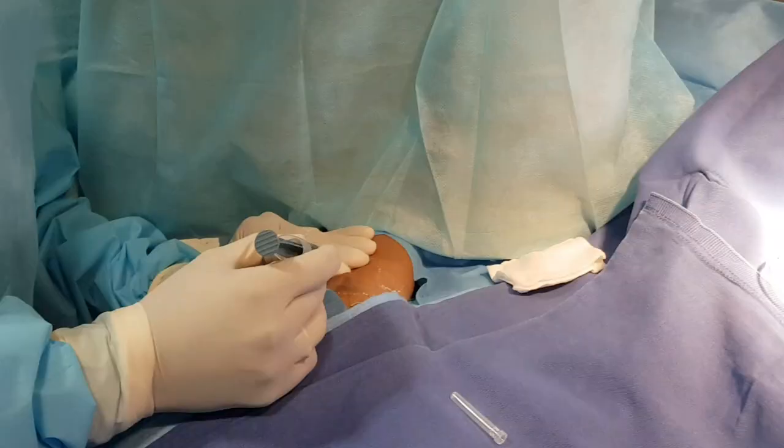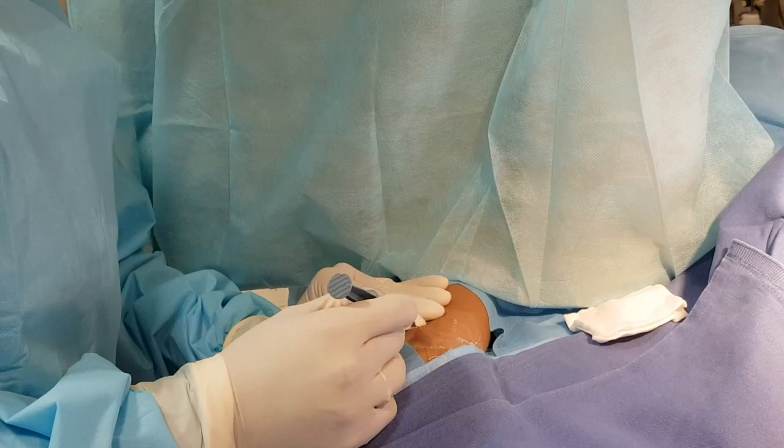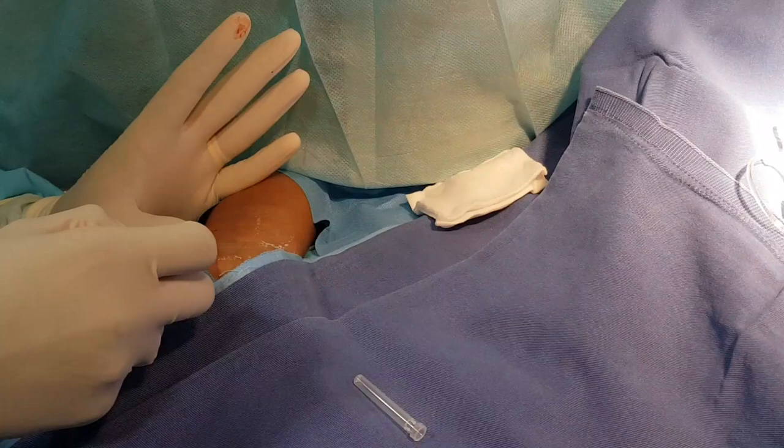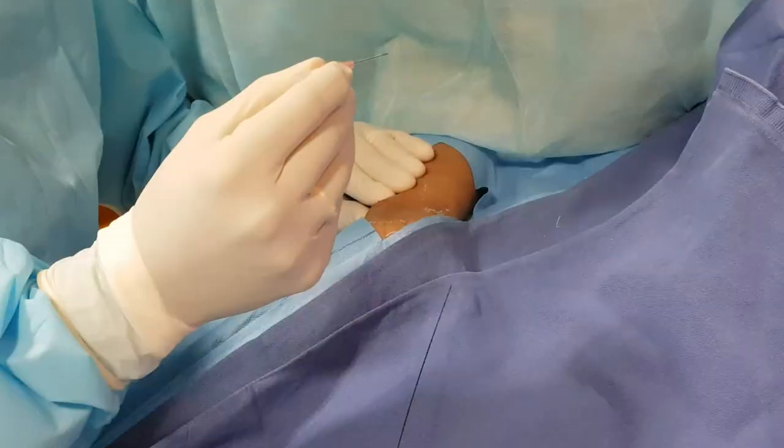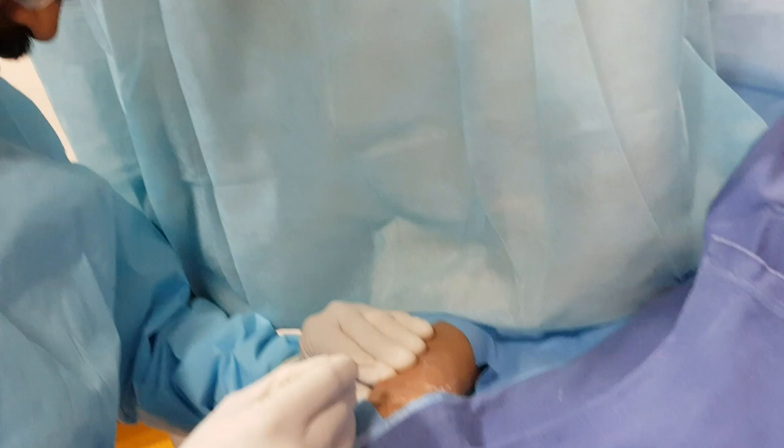The procedure is the same as an angiogram. First we have to give local anesthesia here. This is the subcutaneous tissue above the radial artery. The radial artery is the access to the coronary artery. This is the puncture needle.